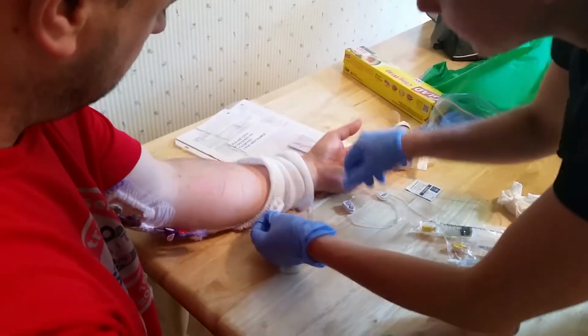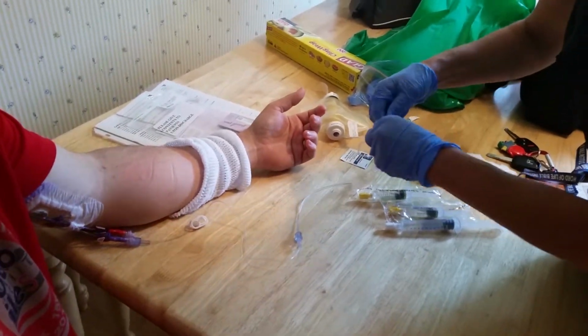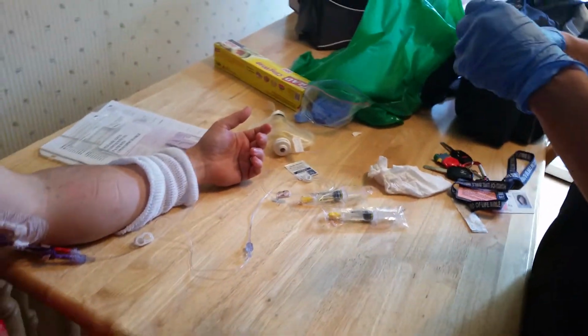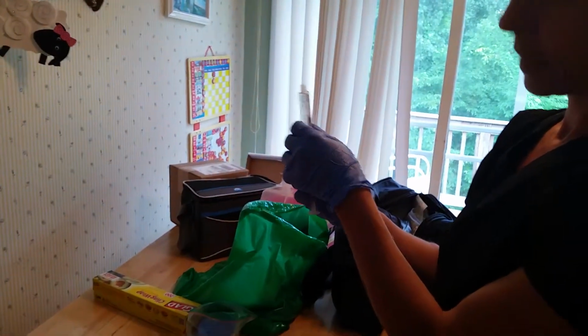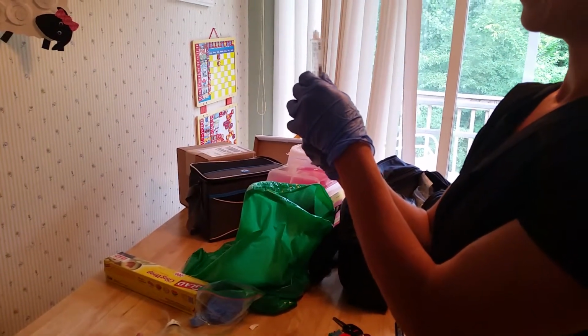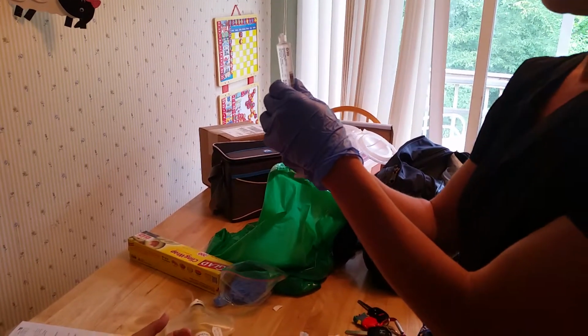Okay. So yeah, I'll clamp it off here and get the saline ready. That's the clamp, because I attached this to the clamp for each line. Right. And until the little bubble comes out the top there, we know that we've got all the air out.